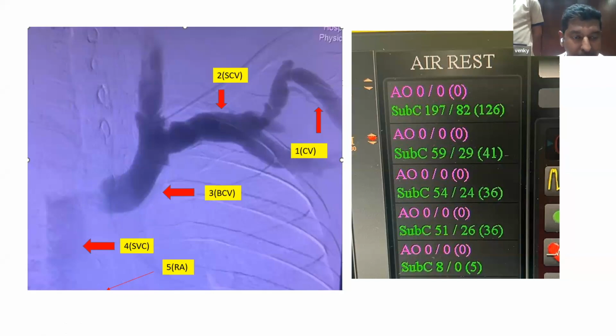In retrospect, that is why the patient did not have any evidence of central venous stenosis like arm edema, facial edema, or prominent veins or collaterals. So if we had done the pressure monitoring before, I would not have touched the central vein at all. Which means now, after the monitoring, it is clear it is the cephalic arch which is significant due to the significant gradient we had seen.